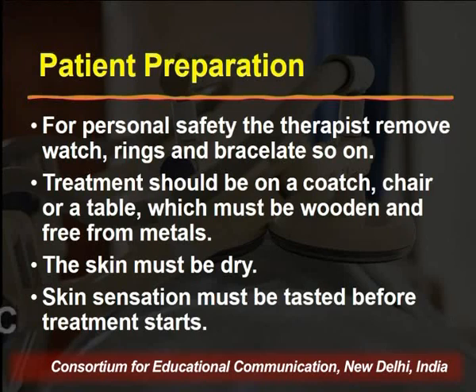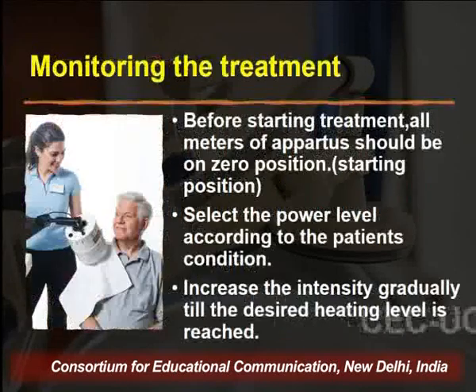Then for personal safety, the therapist removes watch, rings and bracelets, and so on. Treatment should be on a couch, chair or table which must be wooden and free from metals. The skin must be dry. Skin sensation must be tested before treatment starts.